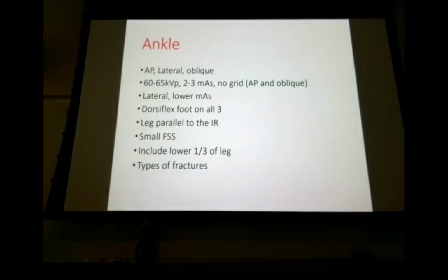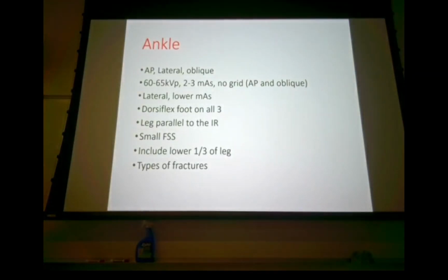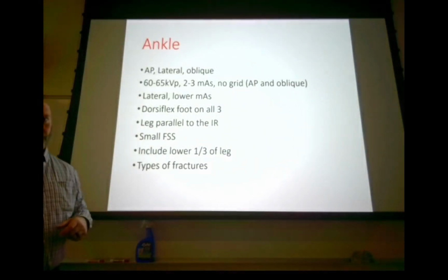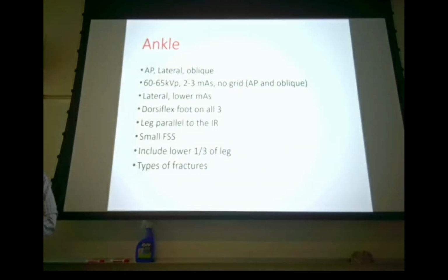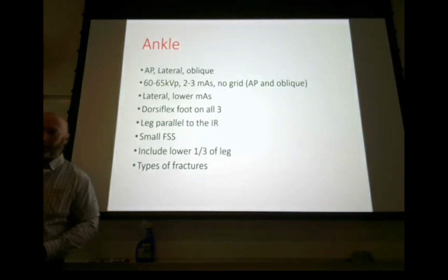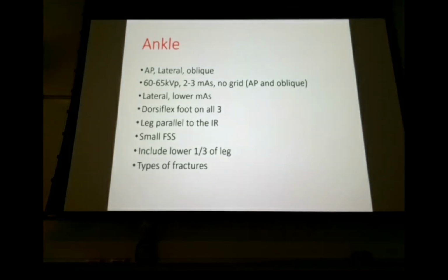Go talk to your ER doc. Say, hey, can we shoot an AP on the leg? And that's what we refer to as a Maisonneuve fracture. It's a French spelling. I'm not going to butcher it, but it's a Maisonneuve fracture. You can look it up. It's spelled like a French word. So yeah, there's a lot of vowels and an X in there. I don't know.